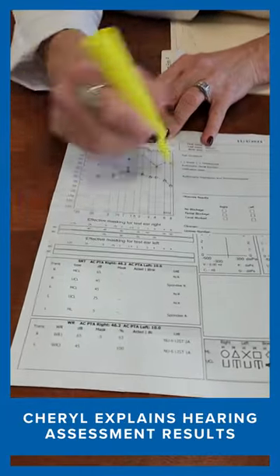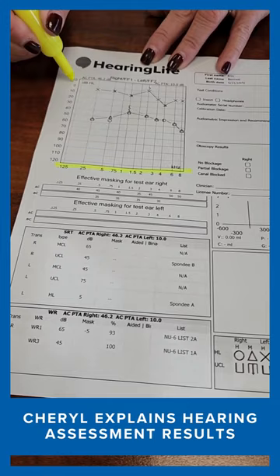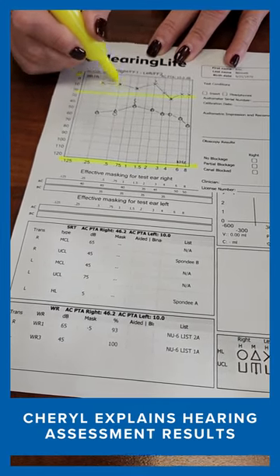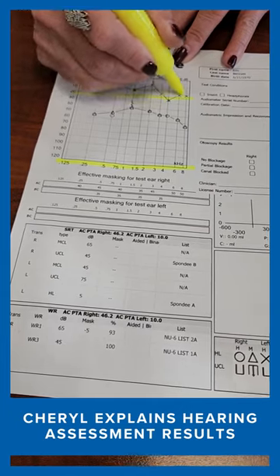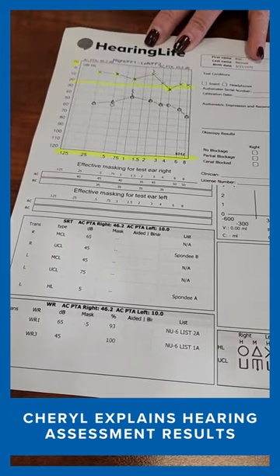So you remember I told you that these are the frequencies I tested you at. Anything that falls between minus 10 and 20 is normal. The X's are your left ear — your left ear is good. This one little one down here, I wouldn't worry so much about.